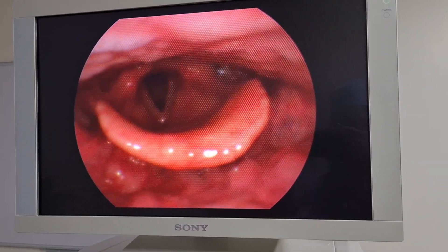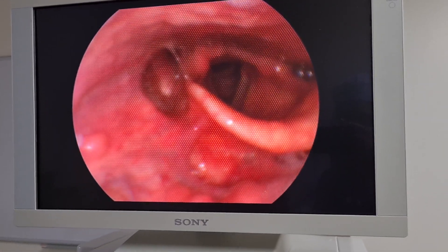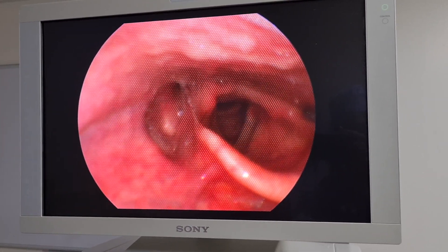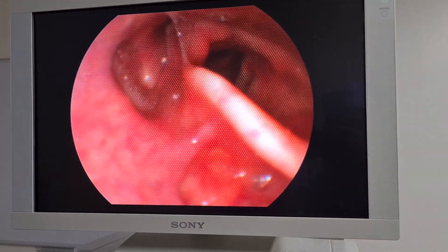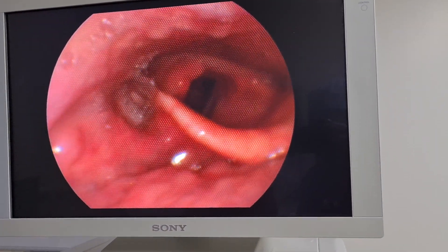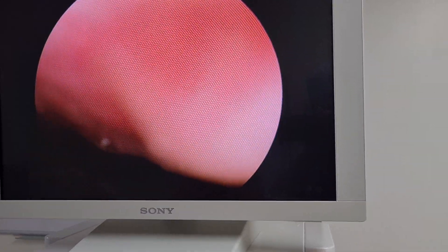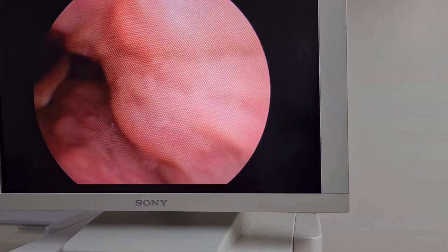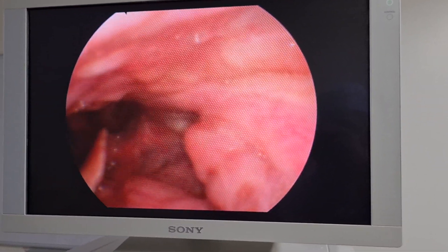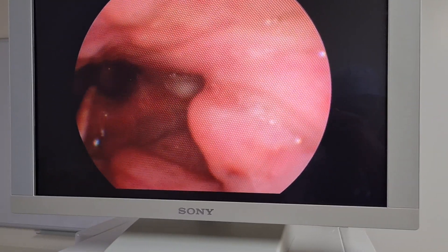Tom, if you rotate your neck to your left all the way — as you can see, we are opening up the right-hand side. There are two channels here called the pyriform fossae, where food channels down. These are areas where sometimes you can get neoplastic changes. It's quite important to check both sides when you are assessing someone.